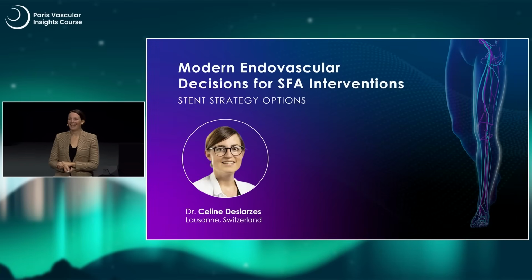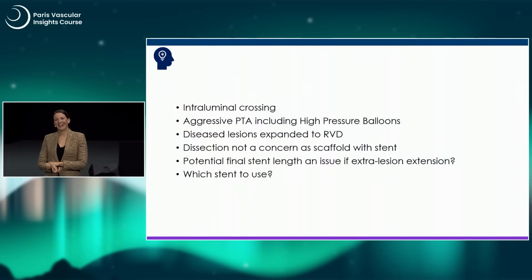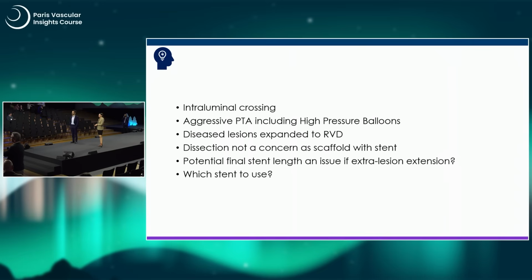Okay, so one other comment? Just as you suggest, if I'm looking for a special balloon, probably why not IVL? We are in a calcified lesion, circumferential, with a channel to go through. With a non-stent strategy, probably I will go for that if it's a special balloon.